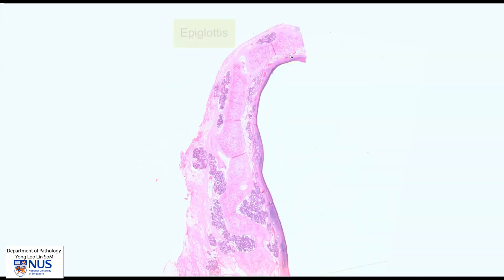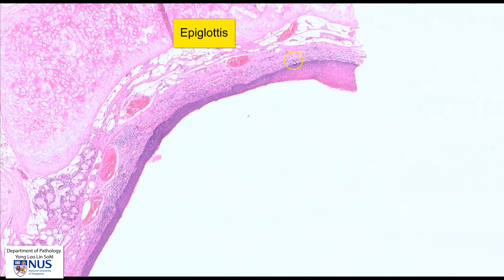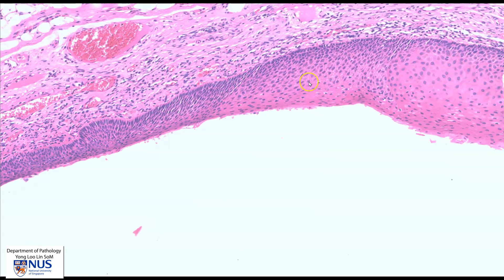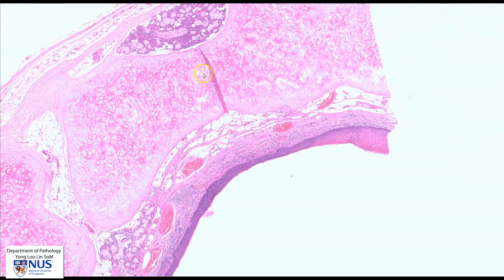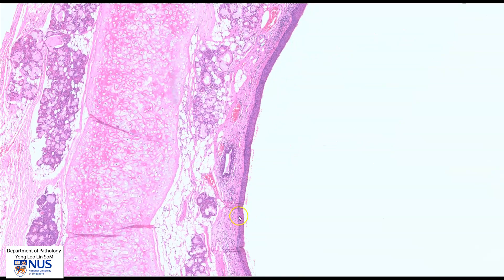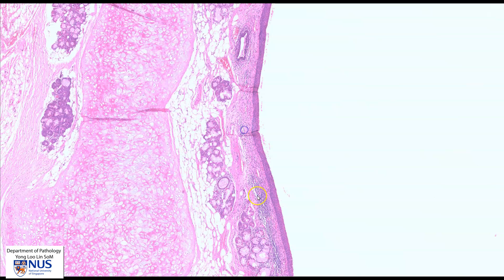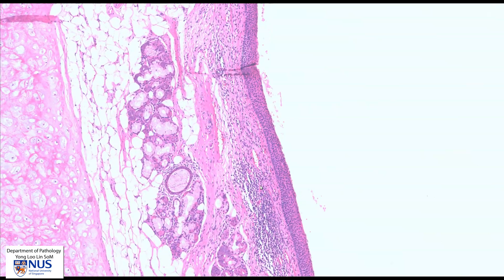Superiorly, we have the epiglottis, which is covered here on its posterior surface by non-keratinizing stratified squamous epithelium. We can see here the cartilage of the epiglottis, and as we move down, usually the more inferior aspects of the epiglottis is actually covered by respiratory type epithelium, which means that we should see columnar ciliated cells.